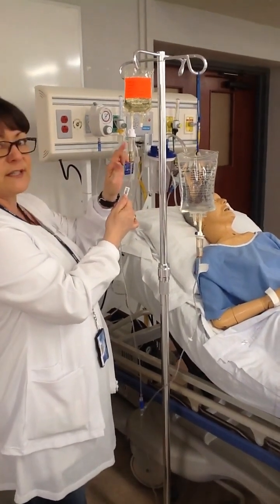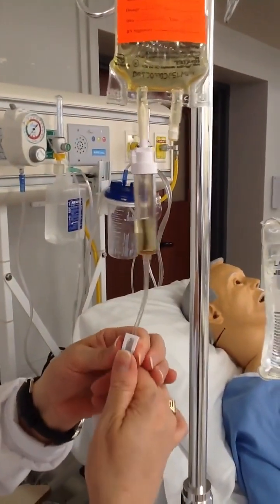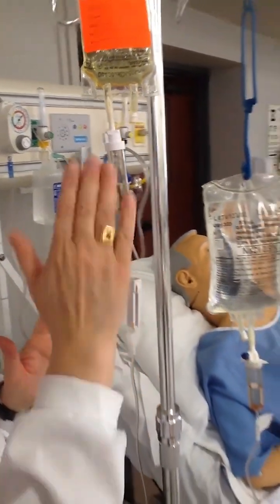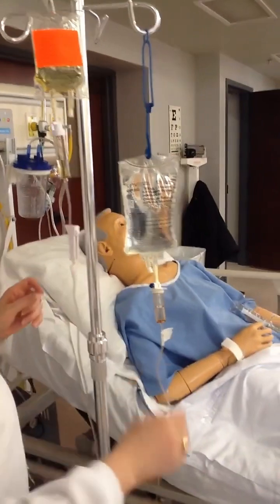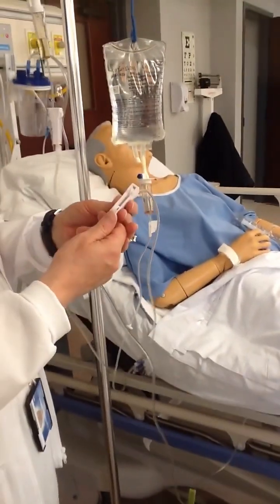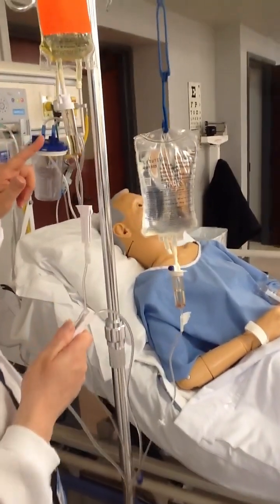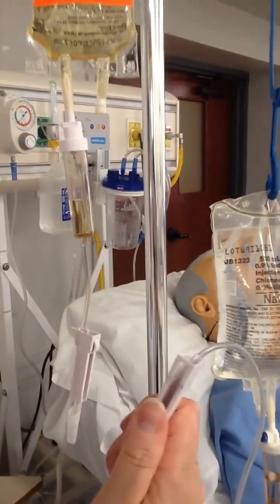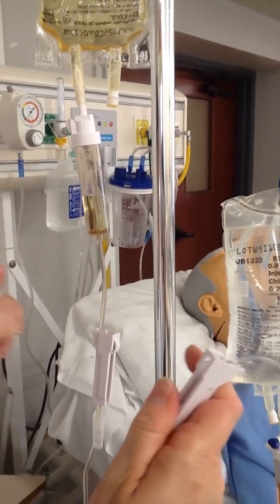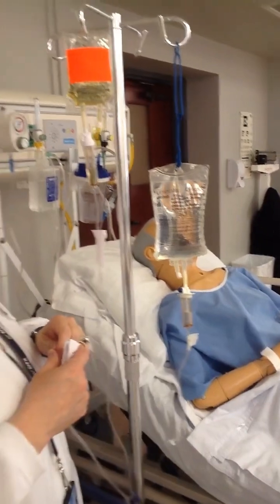And if you watch, if I can just get the camera to watch that chamber, I'm going to turn that roller clamp on all the way, and you're going to see that nothing happens. And that's the way it should be. Nothing's dripping out of there. And if the camera would just stay close with me here. I'm going to get my primary roller clamp. That's the one that controls this. Just watch as I slowly start to turn this roller clamp on, the primary roller clamp. You can see those drops start to initiate. So the primary roller clamp controls the drops for the piggyback set. Okay?